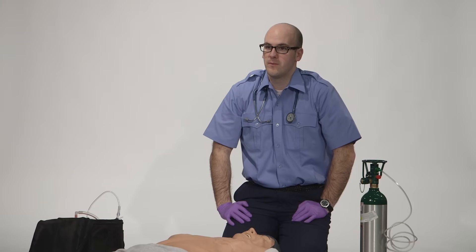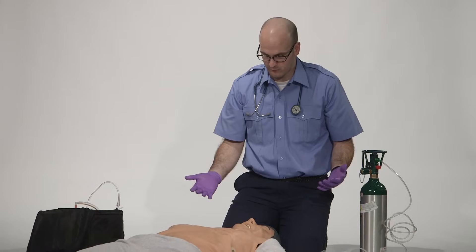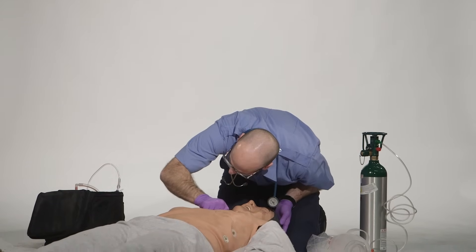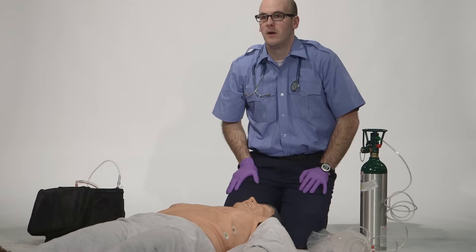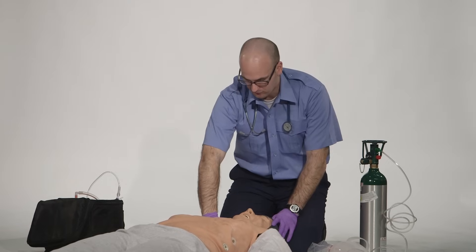BSI — is my scene safe? Your scene is safe. I'm going to check my patient for responsiveness and for breathing. Sir? Sir? The patient is unresponsive and apneic. I'm going to request additional EMS resources and I'm going to check for a pulse.